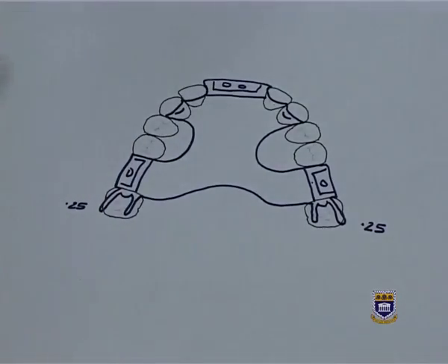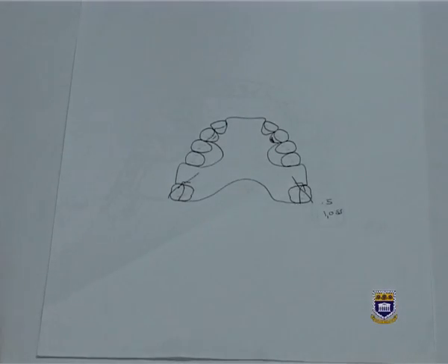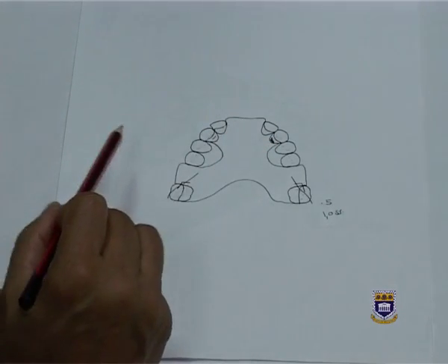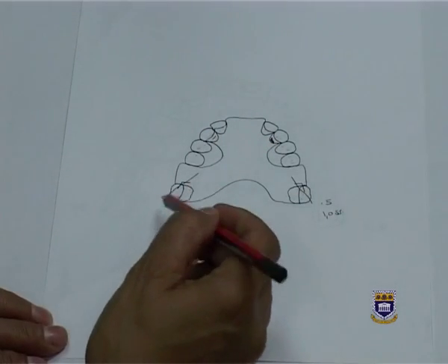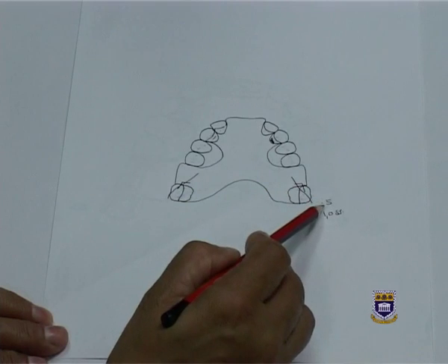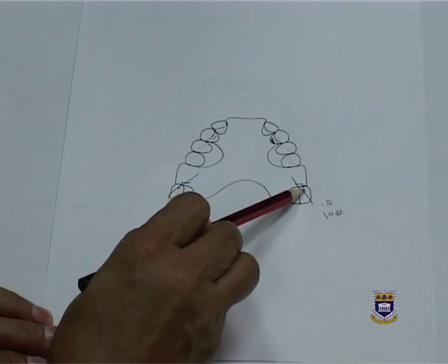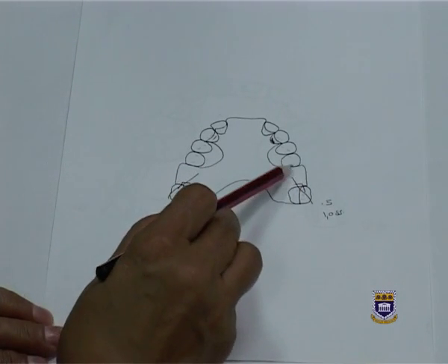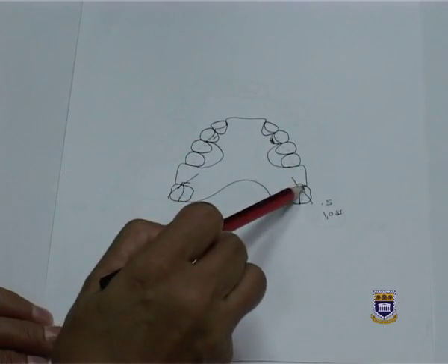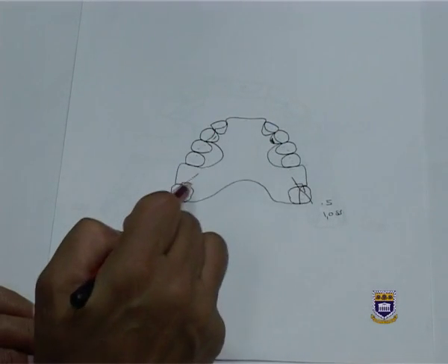In the case where the patient required an acrylic, or if an acrylic partial denture was indicated, if we look at the design, I have also used my 2 canines for support, and I've used my molars, and in this case I have used a C-clasp engaging distal undercut on the molar, a 0.5 undercut with a 1 mm stainless steel. I have attached my half round wire rest to provide support for my saddle. So I have my 1, 2, 3, 4 rest again. I have my 2 clasps, and I have connected all the components.